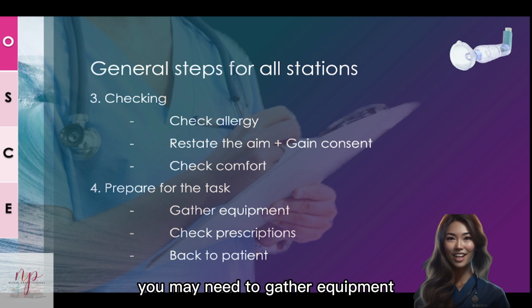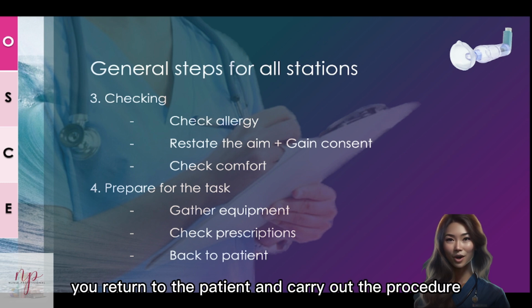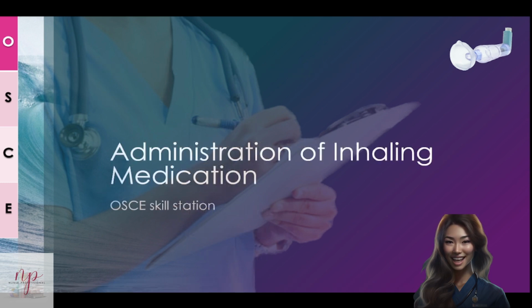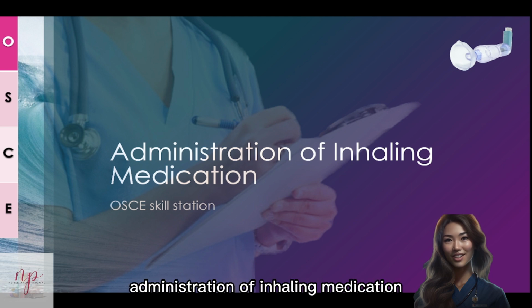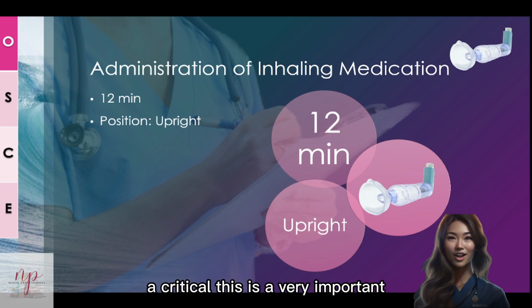You may need to gather equipment. You need to check the prescriptions. And after that, you return to the patient and carry out the procedure. So today's topic is administration of inhaling medication. First of all, for this station, you have 12 minutes. This is a very important position that you need to fulfill.